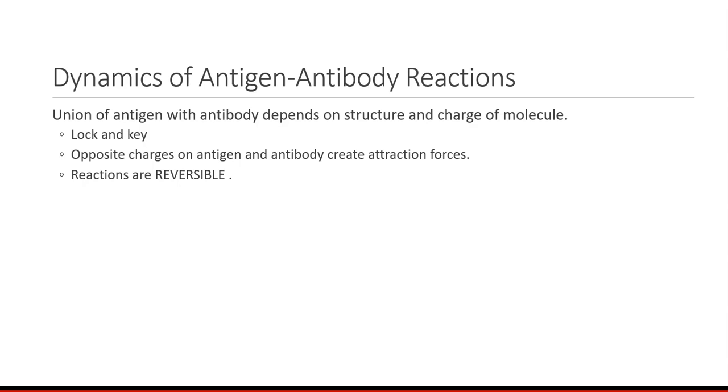Opposite charges on antigen and antibody create attraction forces, and these reactions are reversible. It's very important that you understand this because this is a cause of false negative reactions. If it says read the reaction within a certain period of time and you wait too long, the antibody may dissociate from the antigens and you could end up with a false negative.